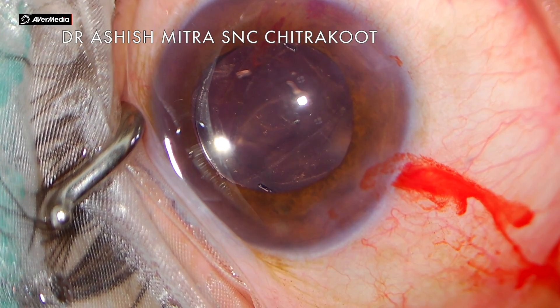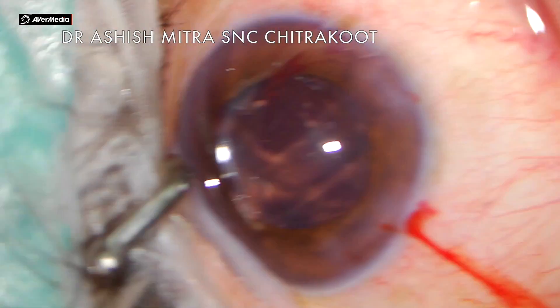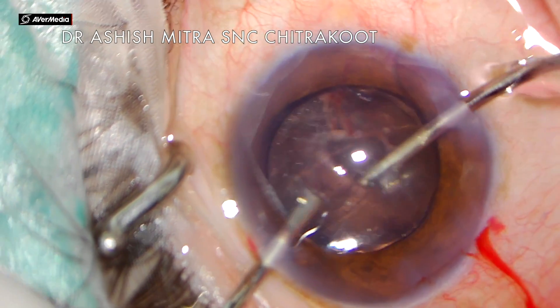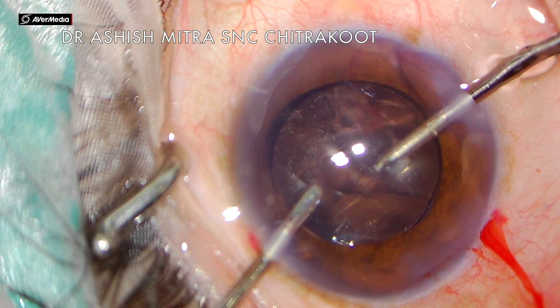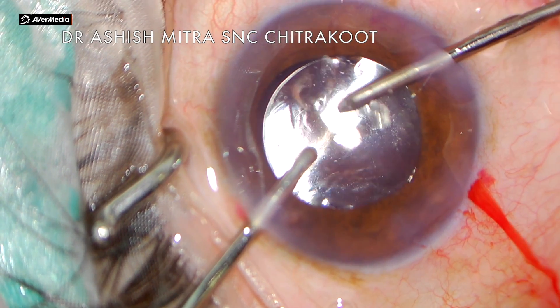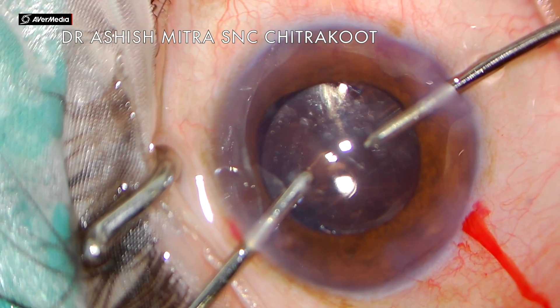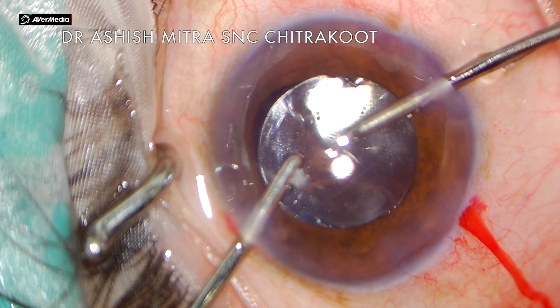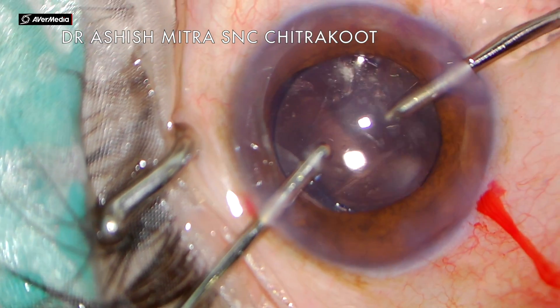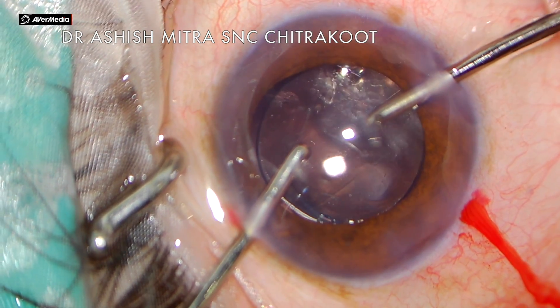As I have said many times, you don't really require triamcinolone to stain vitreous — however, many may disagree. For beginners, if you are in doubt, don't hesitate to use triamcinolone to stain. But vitreous is very well seen by its tell-tale signs: you can see strands of vitreous, you may not be able to center the IOL, there may be peaking of the iris, or your wound may be unstable and leaky. These are all signs that suggest vitreous is still there, and you require more anterior vitrectomy.